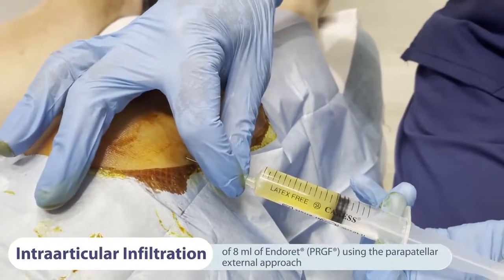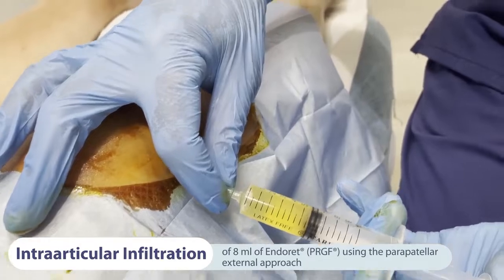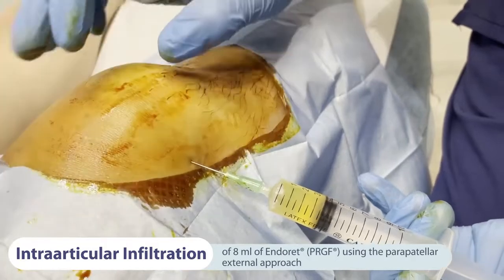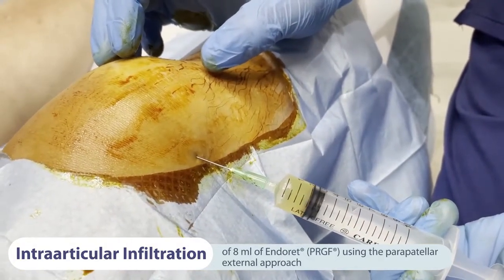Now we can begin the infiltration of plasma rich in growth factors — PRGF Enderet — a leukocyte-free PRP with a moderate concentration of platelets. The first step is the intra-articular infiltration of 8 millilitres of freshly activated PRGF using the parapatellar external approach.